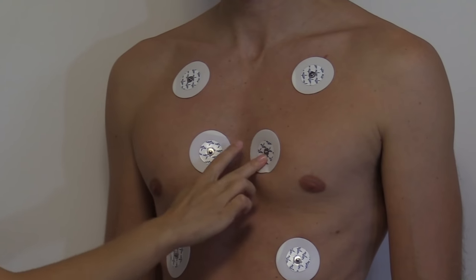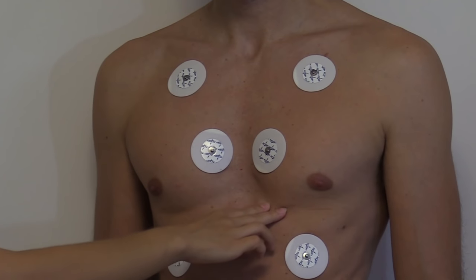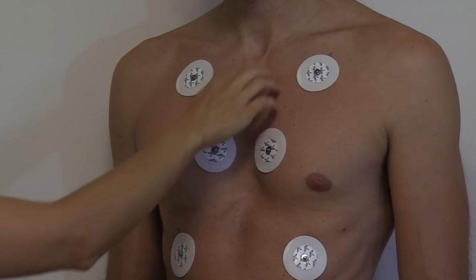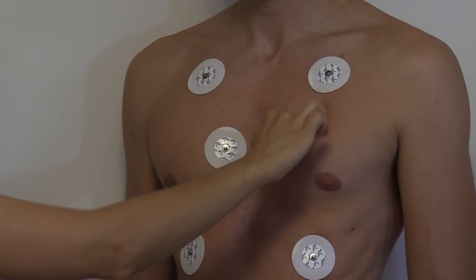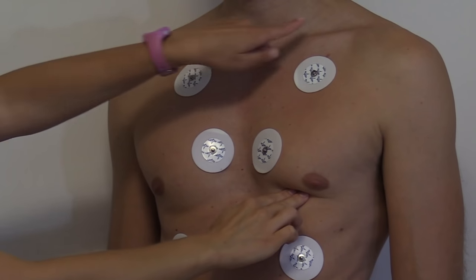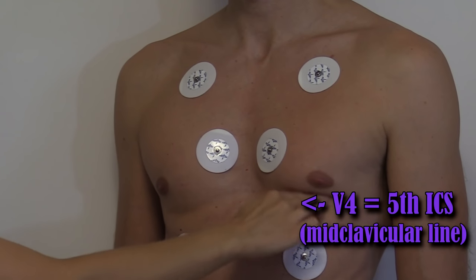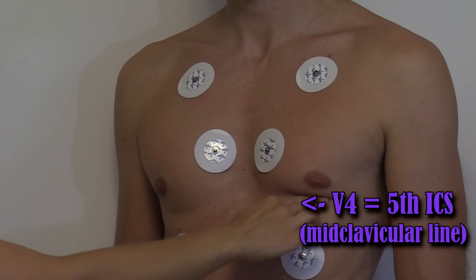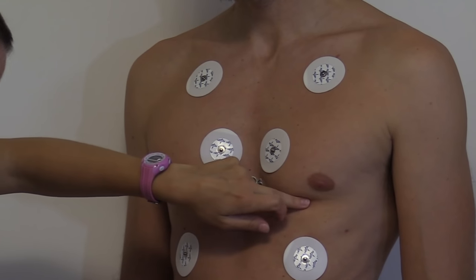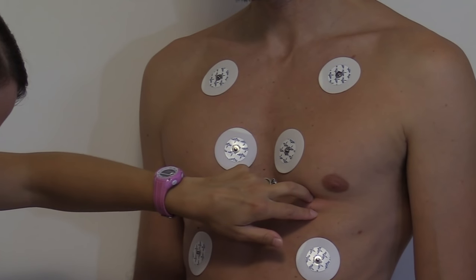We're going to skip V3 for a second. We're going to go to V4 first — V4 is found at the fifth intercostal space. Find your landmarks: second, third, fourth, fifth — and we're going to go mid-clavicularly, so midway of the clavicle. That is going to be V4. Cleanse the skin, rough it up, and then place our electrode.